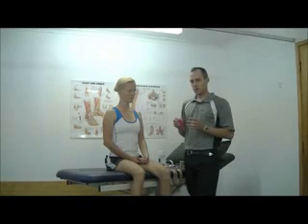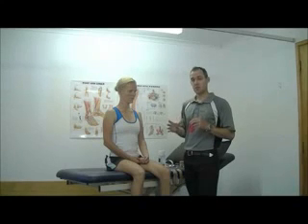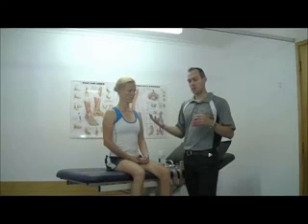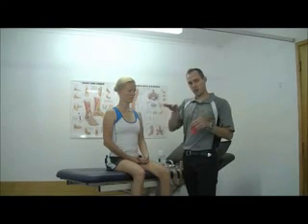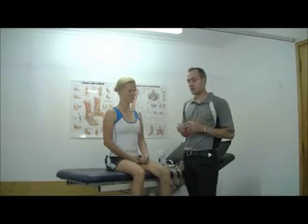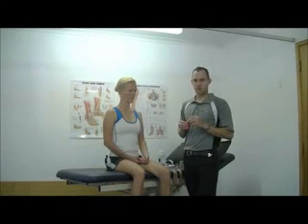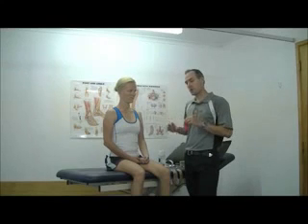Now, kinesio wasn't developed primarily to be a strong mechanical tape. The aim was to have an elasticity and a thickness similar to the skin, and by doing this, when it is put on generally in a lengthened position, when the body part is then shortened, it gathers up, we get these convolutions and this lifting of the skin, which reduces interstitial fluid pressure, enhances lymphatic drainage, takes pressure off pain-sensitive structures, etc.